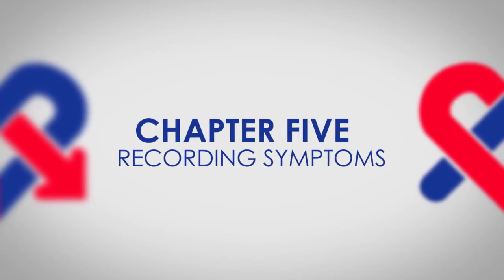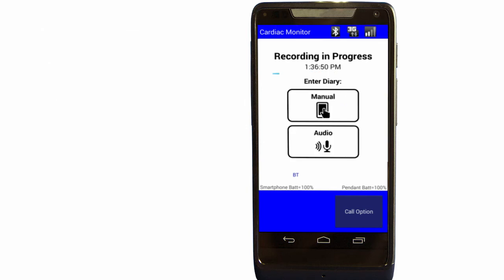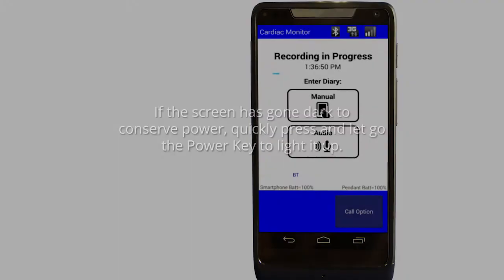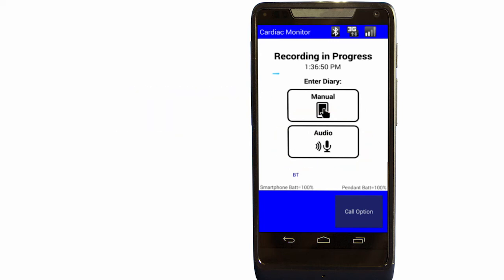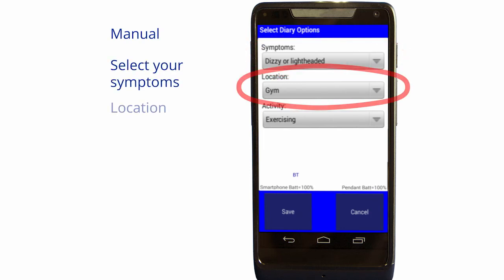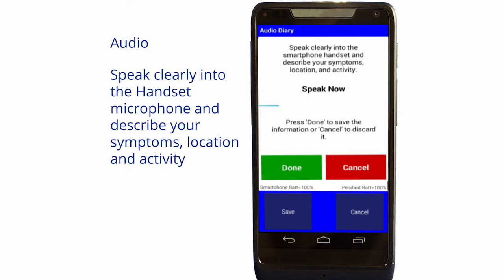Recording and sending your symptoms. When you experience a symptom, or at other times as directed by your doctor, press the symptom button on the pendant or tap Symptom on the smartphone. The handset will display recording in progress. If the screen has gone dark to conserve power, quickly press and release the power button to light it up. Tap either Manual or Audio. Manual means you will select from a list of options; Audio means you will speak your diary entry. For Manual, from the three drop-down menus select your symptoms, location, and activity, then tap Save. For Audio, speak clearly into the handset microphone and describe your symptoms, location, and activity, then tap Done.